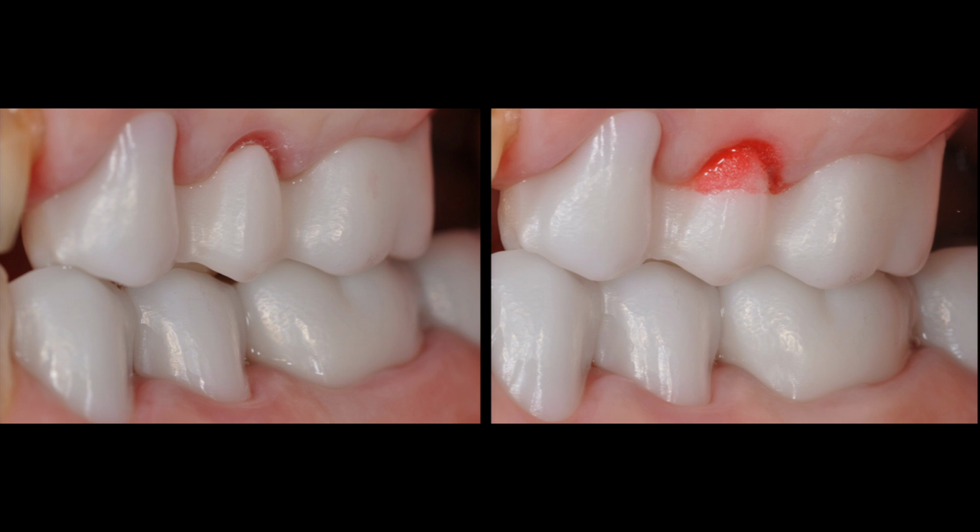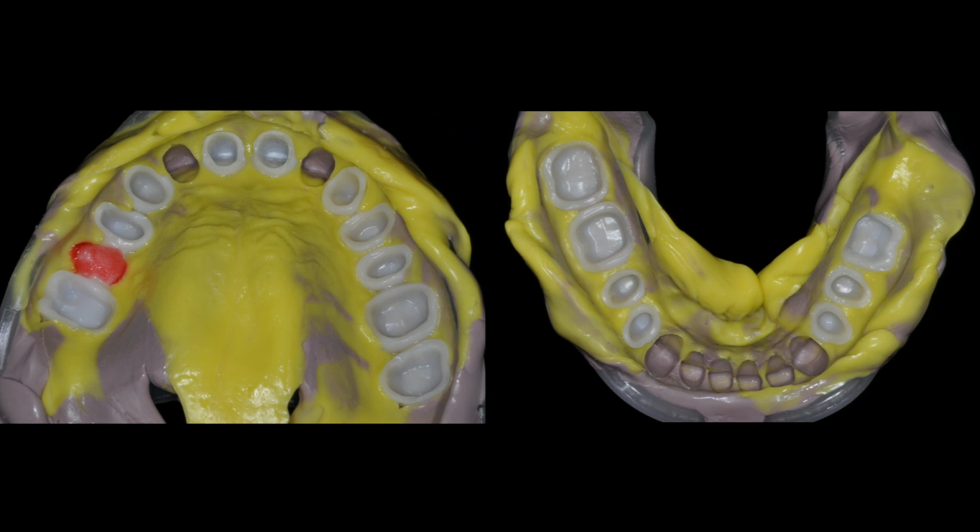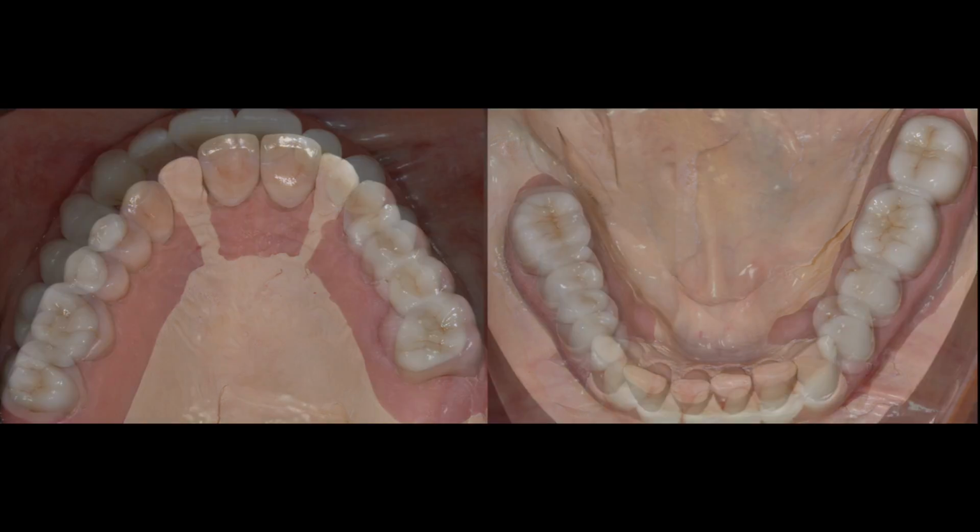So we do our framework try-in. This is an opportunity not only to assess the fit, not only to pick up the pontic site, we have an ovate pontic site here, but also to assess occlusion and make some adjustments as needed. And here we go ahead. We have all our copings and frameworks in place, and we do a pickup impression. And this will allow the technician, now as the tissue is not retracted, to design the cervical contours of the restorations in an ideal manner.